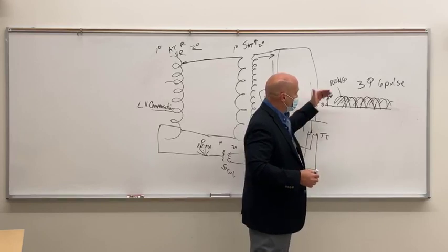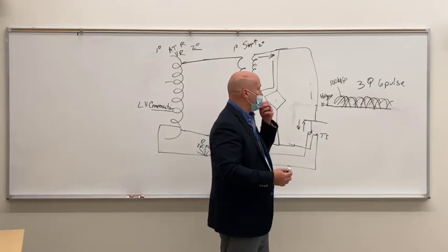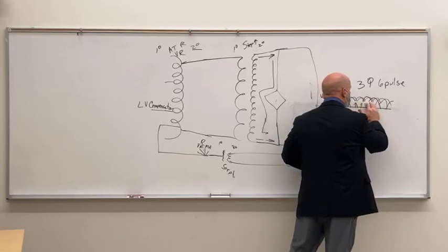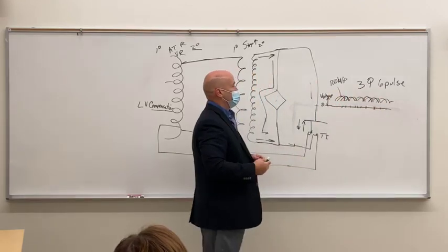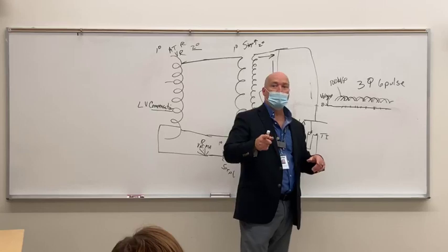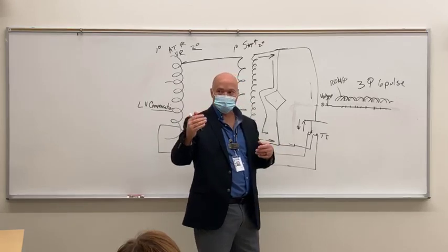So this is output at the anode. Okay, so it never drops completely to 0. Each pulse does drop to 0, but the overall beam energy never drops to 0. By the time we introduce filtration, we're going to eliminate all that. So what we're left with, conversion from single phase to 3-phase, is an X-ray beam that once it emits from the X-ray tube truly does not ever drop to 0. So we get a much higher beam quality.